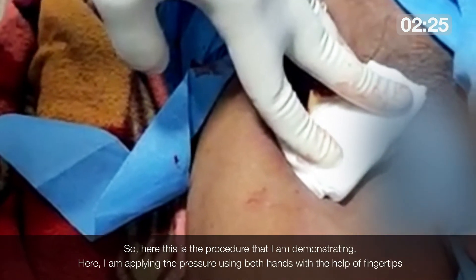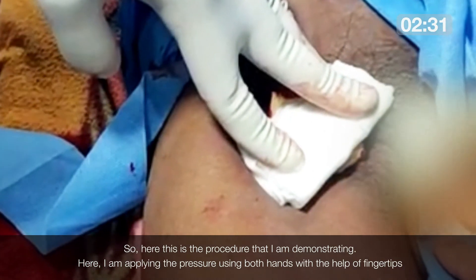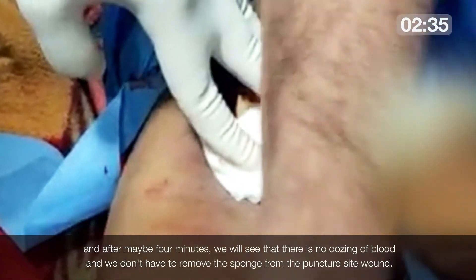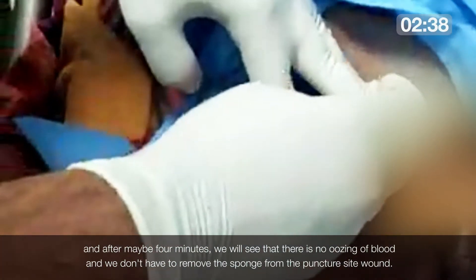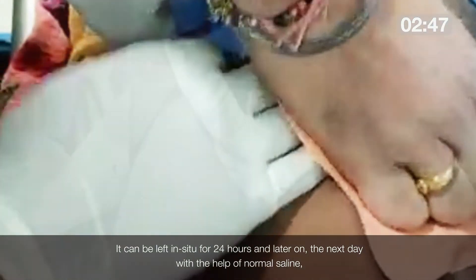Here I am demonstrating the procedure — applying pressure using both hands with fingertips. After about 4 minutes, we will see there is no oozing of blood, and we do not have to remove this sponge from the puncture site wound. It can be left in situ for 24 hours, and the next day with the help of normal saline it can be easily taken off, ensuring good hemostasis.